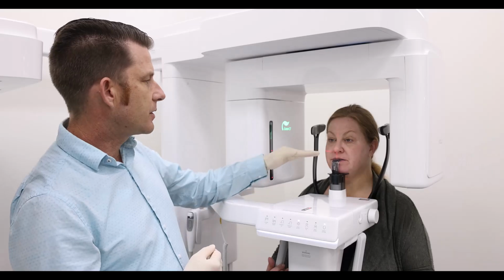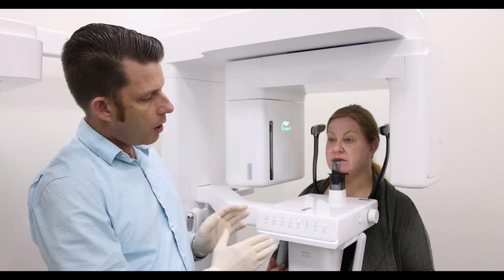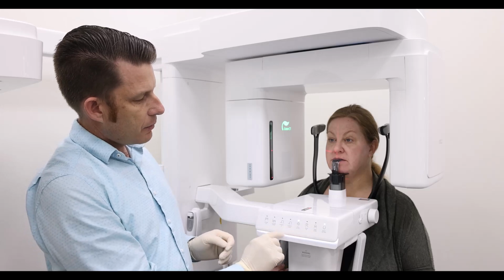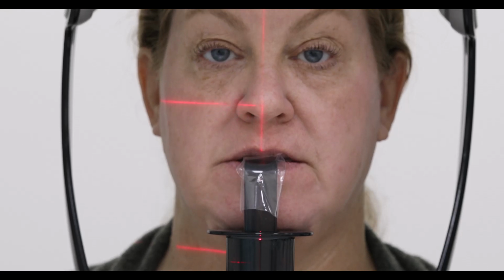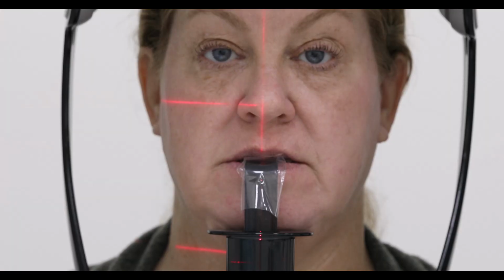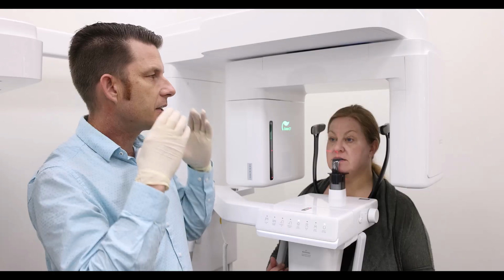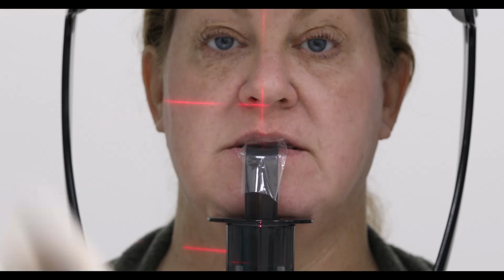If we did need to adjust the patient height up or down for capture, on the front of the touchpad, I actually have chin rest up or down. So you can see if I move the chin rest down, it's going to lower the patient down, therefore raising the scan higher or further superior. If I raise the chin rest up, we can see that the center of the field of view has lowered, so we're going to capture further inferior.